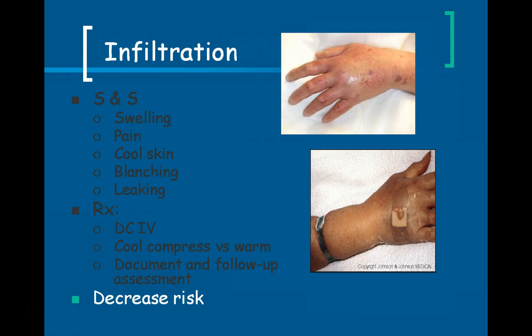We want to make sure when we are inserting the IV that we're doing it correctly with the bevel of the needle up, so there's less chance of the vein getting nicked. And I'll show you that when we do our unit on IV starts.